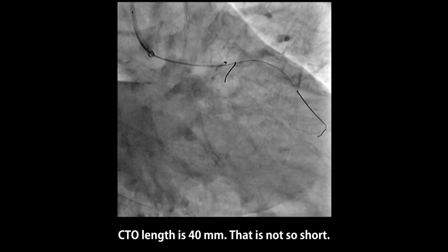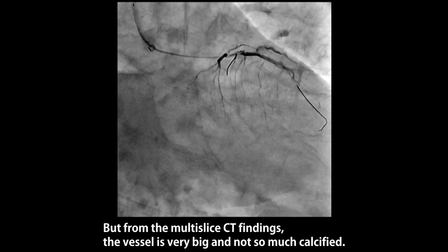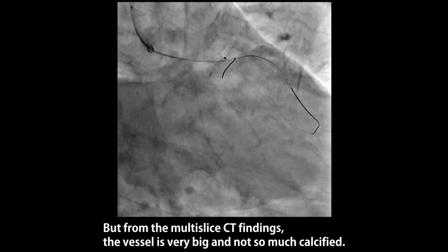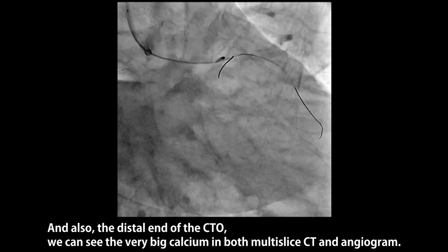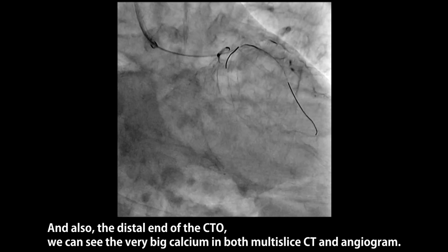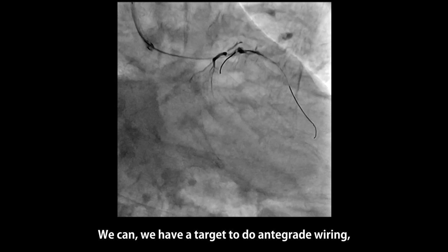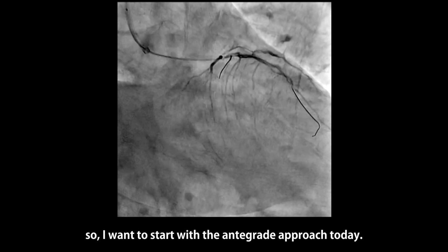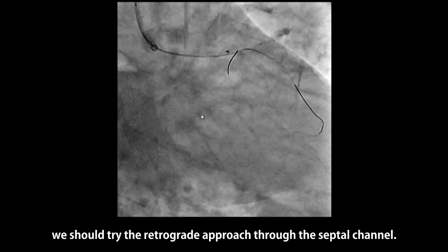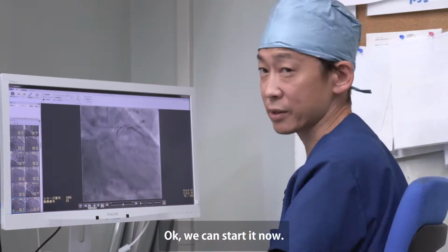Today we of course studied the integrated approach. The CTO length is 40 millimeters. That is not so short, but from the multi-slice CT findings, the vessel is very big and not so much calcified. Also at the distal end of the CTO, we can see very big calcium in both multi-slice CT and angiogram. So we have a target for antegrade wiring, and I want to study the integrated approach today. If the integrated approach fails, we should try the retrograde approach through the septal channel. Okay, we can start now.